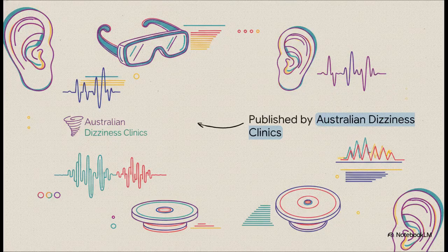Okay, let's jump right in, shall we? Welcome back to part 2 of our explainer series on interpreting vestibular function testing. Today, we're locking in on 2 absolute heavy hitters, caloric testing and the rotational chair. You can think of these as the slow end and mid-frequency probes of vestibular function.